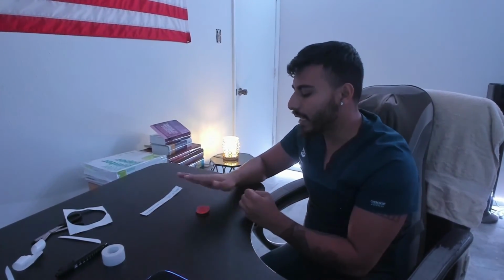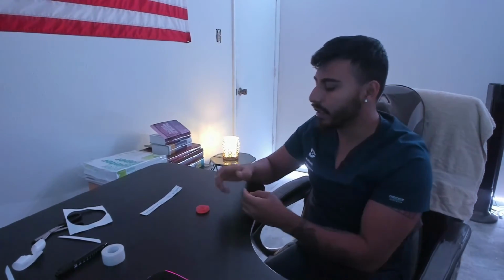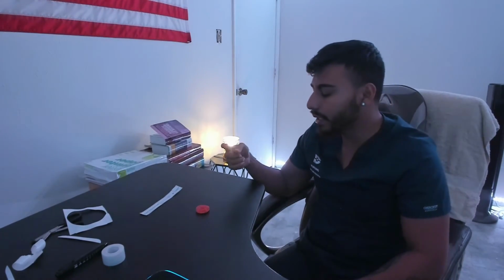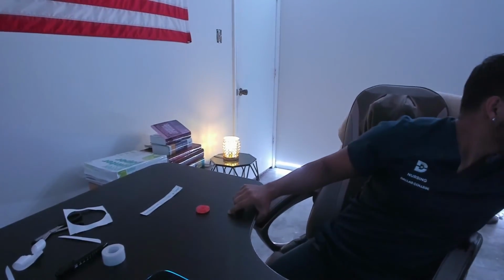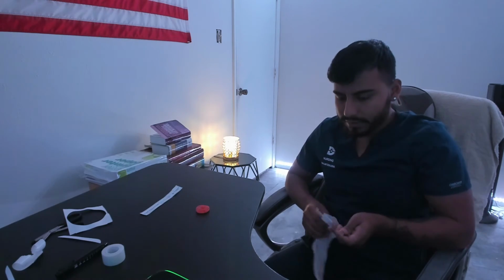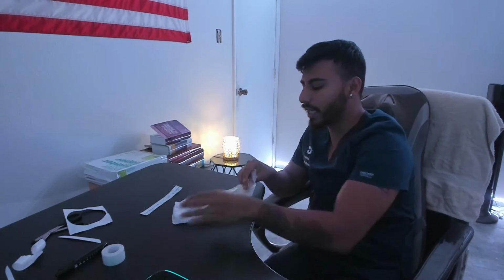So once I establish that, I can go ahead and unclamp it. I would save the clamp so I can reuse it for later. I would empty out the contents into a toilet, a bedpan, or a graduated container. I would measure the volume, observe the stool characteristics. Since it is a drainable pouch, I would clean the end of the pouch, this part.